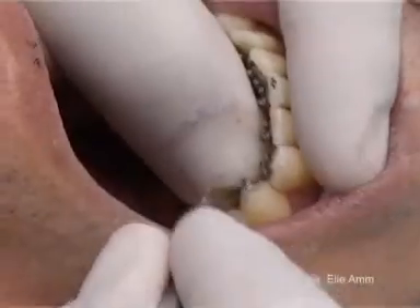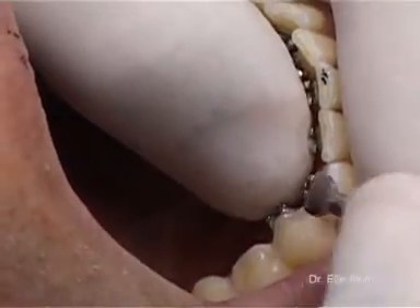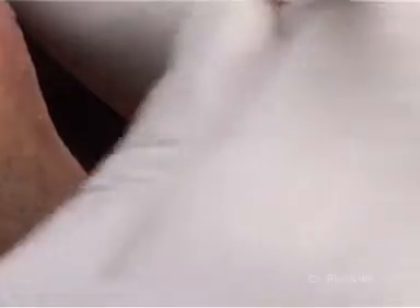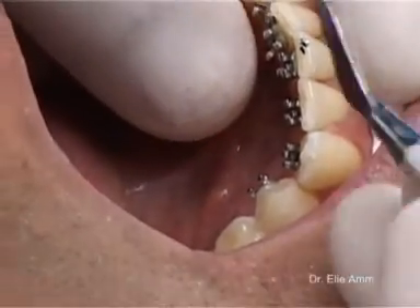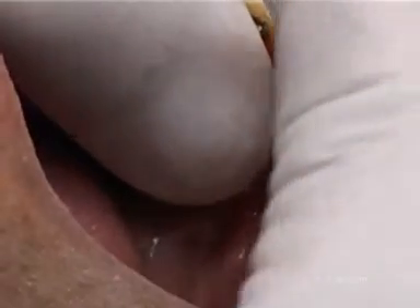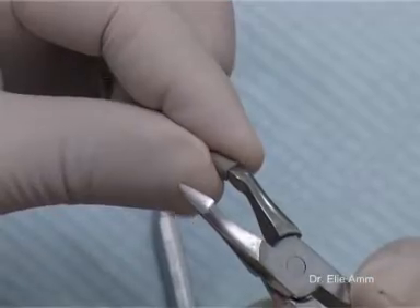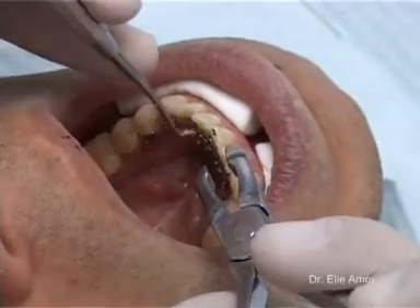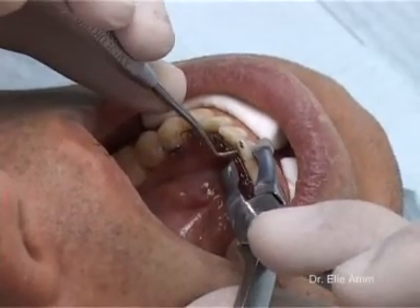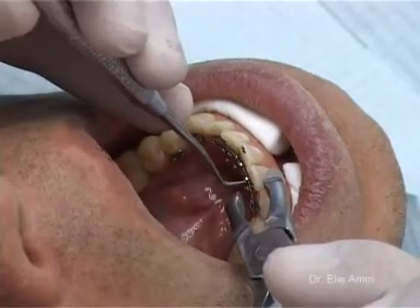Opening of the wings of the 2D lingual brackets with the lingual probe or spatula from Forestadent. Capping one prong of a wing guard plier to avoid instrument slipping and to protect the labial enamel during wire insertion and bracket closing. Insertion of the wire into as many slots as possible.